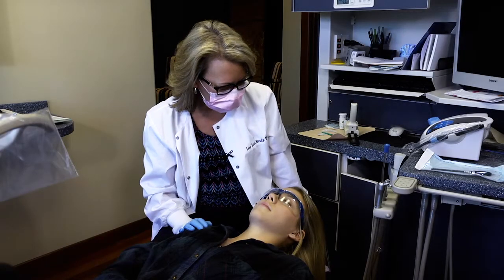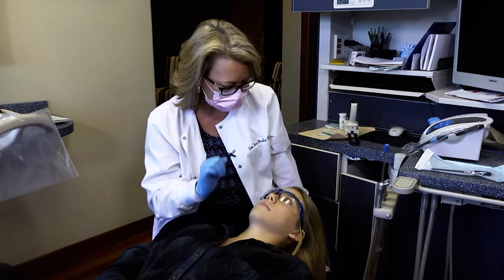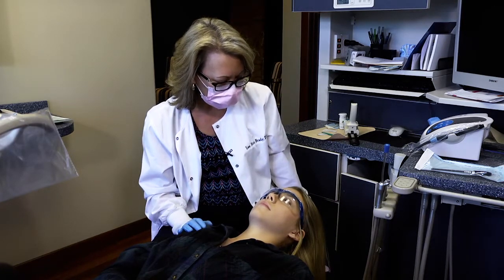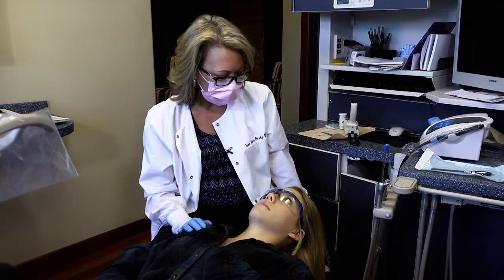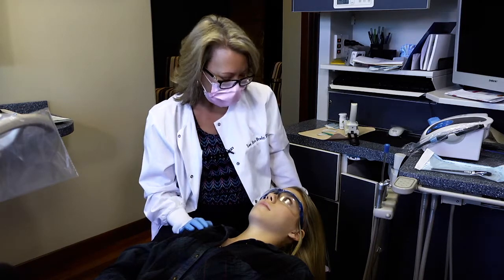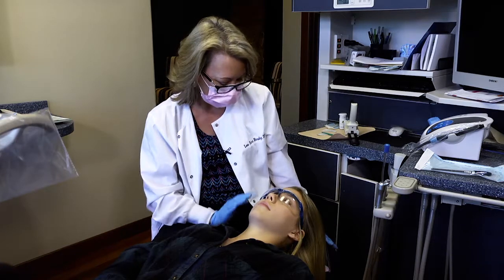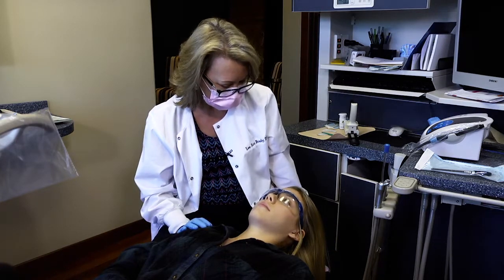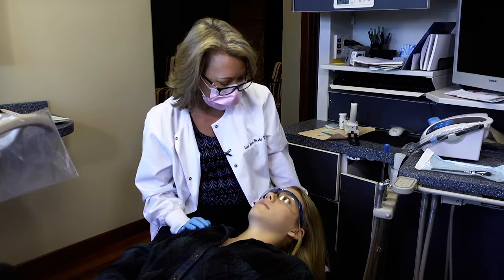So Jenna, what we're going to do now is we're going to actually fabricate a little device or appliance that you can actually wear over your top teeth. And we may use it in a couple of different ways. We may actually use it during your dental visits, during those rest periods. We would actually have you put this device in so that we can really rest those muscles and take some pressure off of your jaw joints. We're also going to send you home with this device so that you can use it at home.